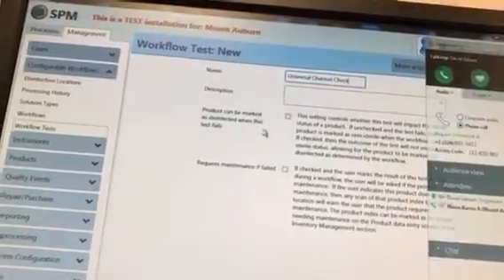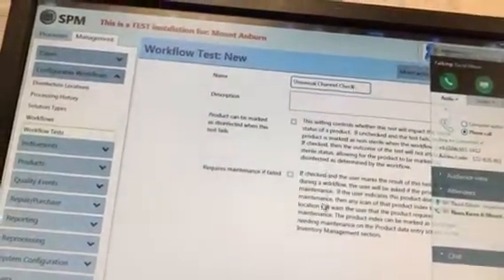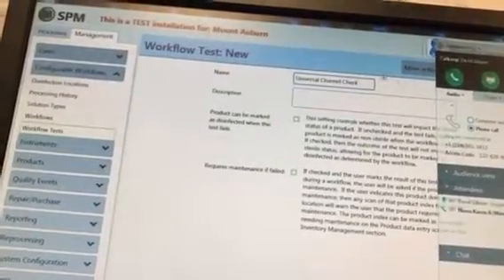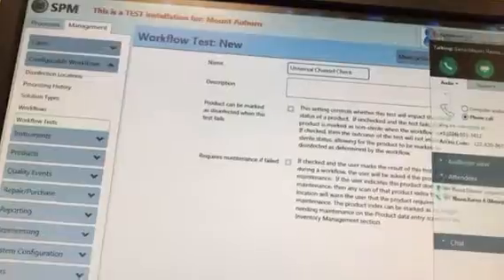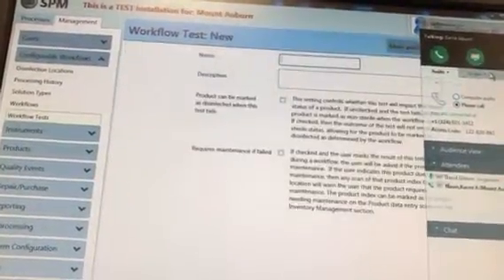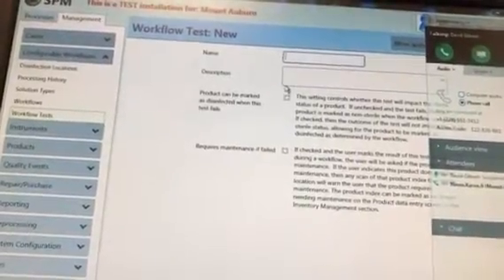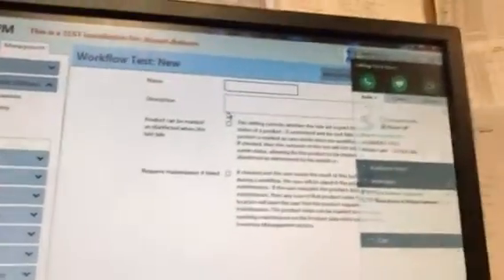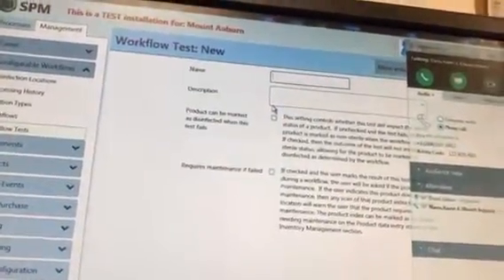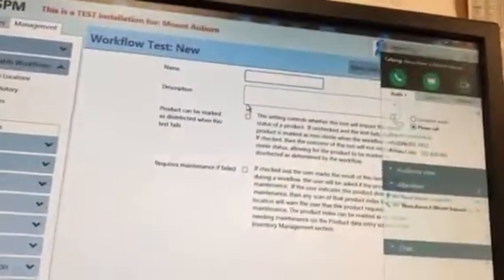I don't think we'd want to check either of these two, because if the protein test fails, it needs to be reprocessed, right? And that doesn't have any impact on the maintenance of it. No, it doesn't. Okay. And then the third one we want is for the peracetic acid. Is that right? The indicator telling us that the peracetic acid went through the sterile process.